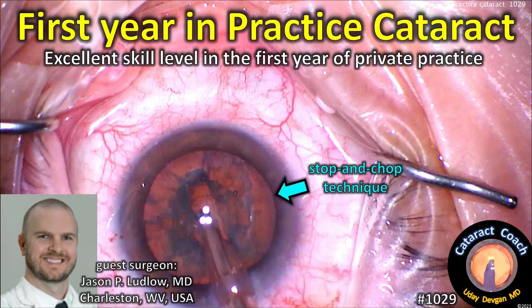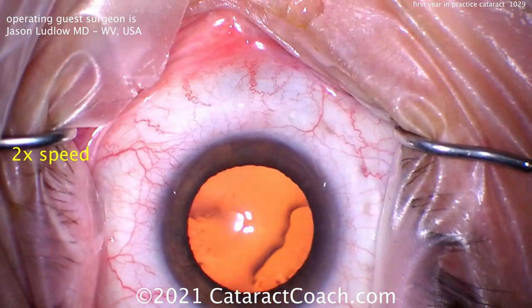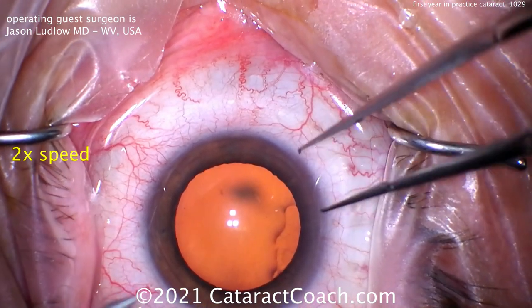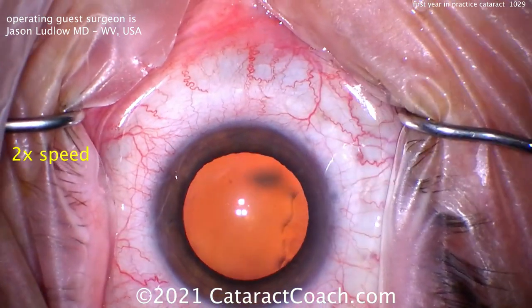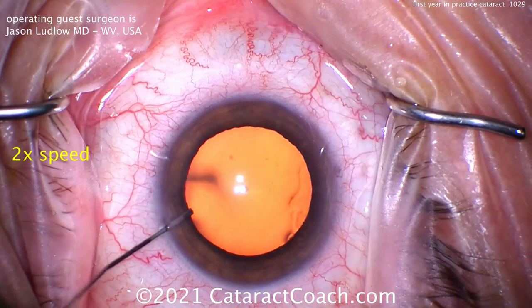Welcome to cataractcoach.com. Our guest surgeon is Dr. Jason P. Ludlow from West Virginia, USA, in his first year of private practice. This is excellent skill level for the first year. Here's his routine stop-and-chop case. After completing medical school, internship, residency, and perhaps a fellowship, he's ready to go out in the real world. Let's watch this case.